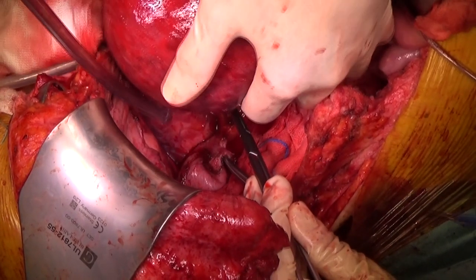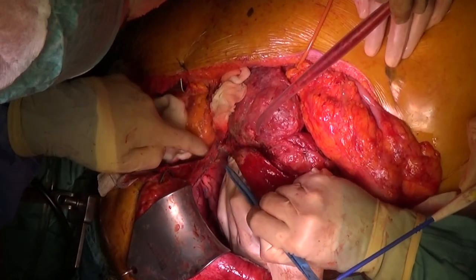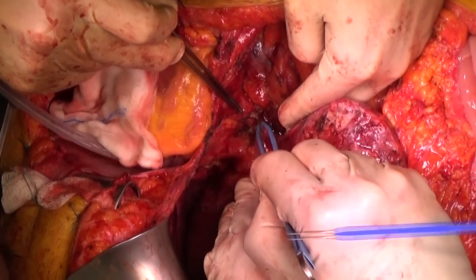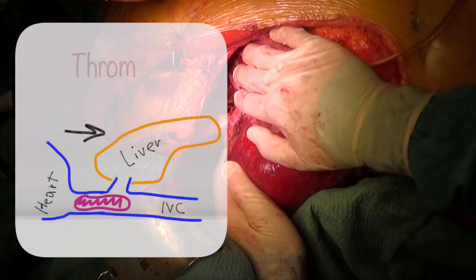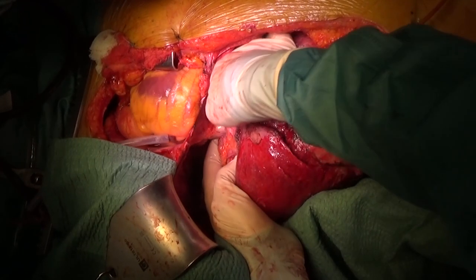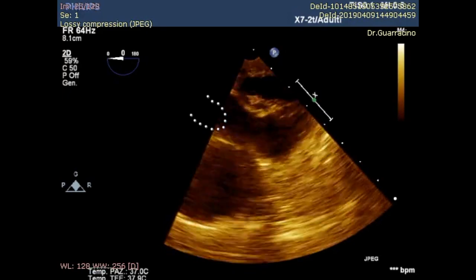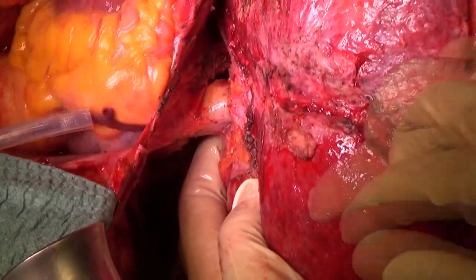Diaphragmatic section and sternotomy were required to access the suprahepatic portion of the IVC up to the atrium. Once the suprahepatic IVC was exposed, complete control of the structure was obtained. Pulling the liver downward and encircling the suprahepatic IVC caused thrombus displacement. Transesophageal ultrasound documented the disappearance of the lesion from the atrium, confirming the possibility to remove the lesion without heart involvement.